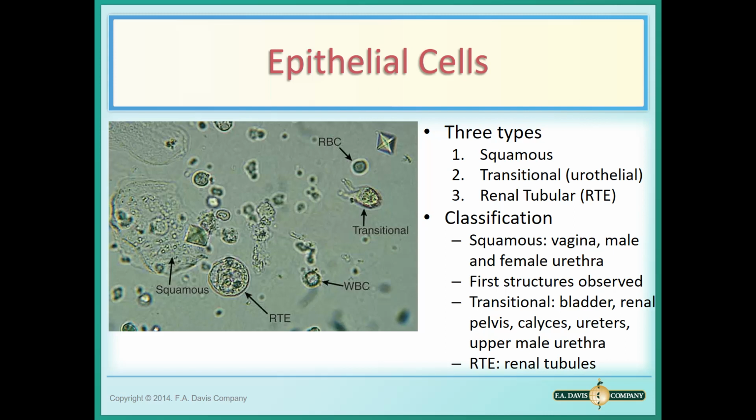So I mentioned to you a moment ago about epithelial cells and how important it is to be able to distinguish them from white blood cells. Here's a white blood cell. Here's a white blood cell. You can see the relative size here.